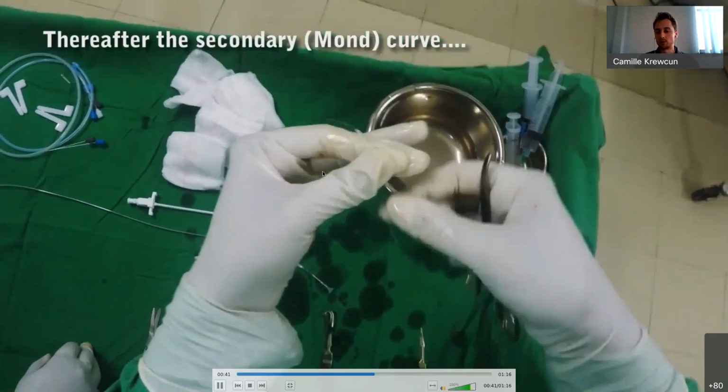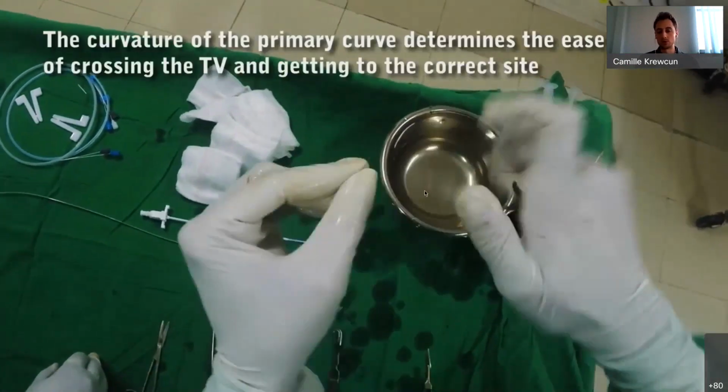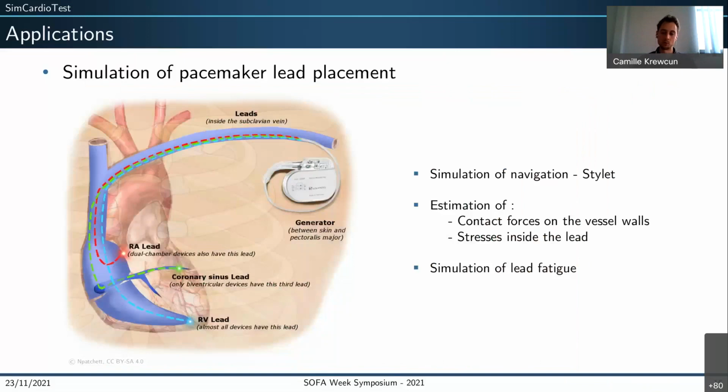But obviously what happens here is that the stylet undergoes a huge plastic deformation. And so it's useful, if you want to model navigation in a proper way, to be able to model the plasticity phenomena occurring in the stylet, because they will have an impact on what happens during the lead insertion.